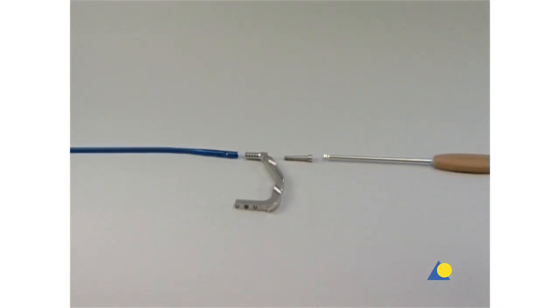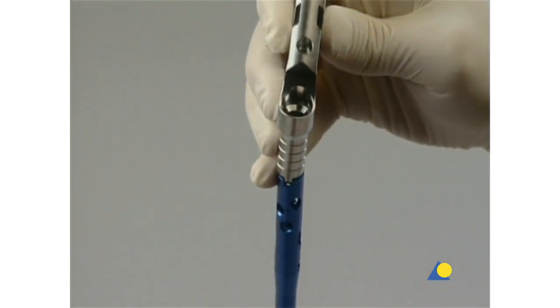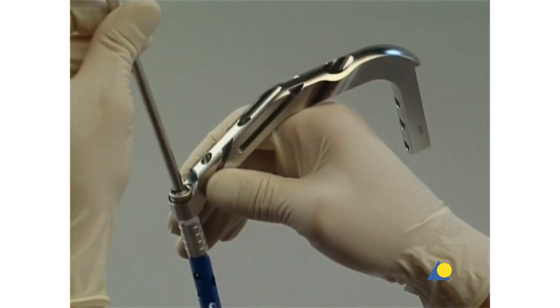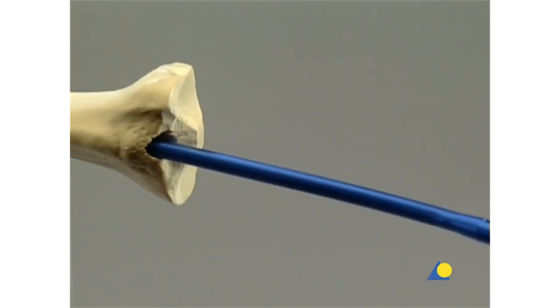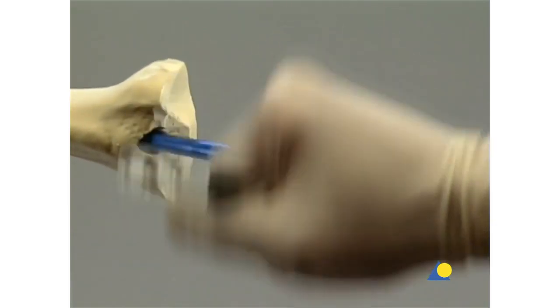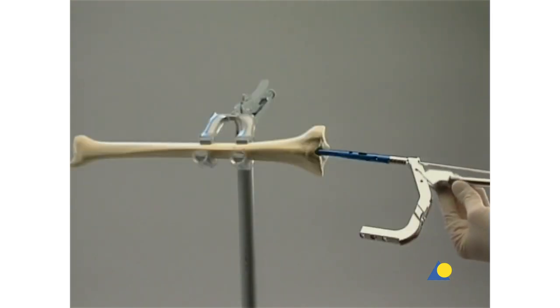The insertion handle is directed anteriorly and the tongue of the handle is matched to the notch in the nail. The connecting screw is placed through the insertion handle and threaded into the nail using the hexagonal screwdriver with spherical head. With the insertion handle, the nail is introduced into the medullary canal. Slight rotational movements can help the insertion. The passage of the nail across the fracture is monitored with the image intensifier in two planes to avoid malalignment and additional iatrogenic fractures. If necessary, light hammer blows may be used.